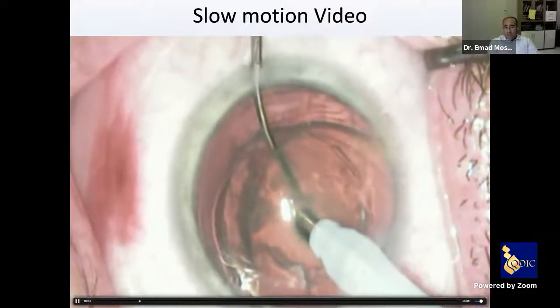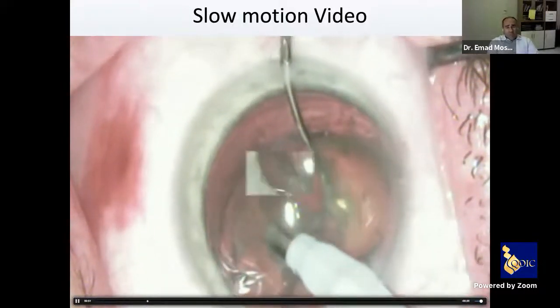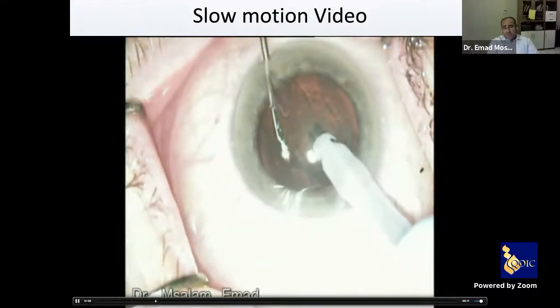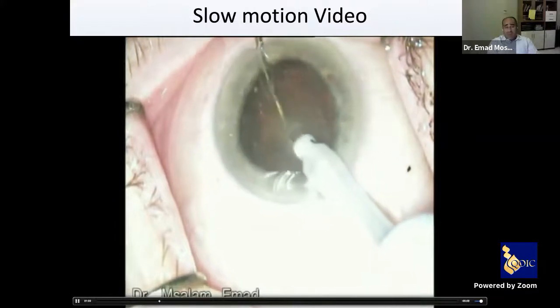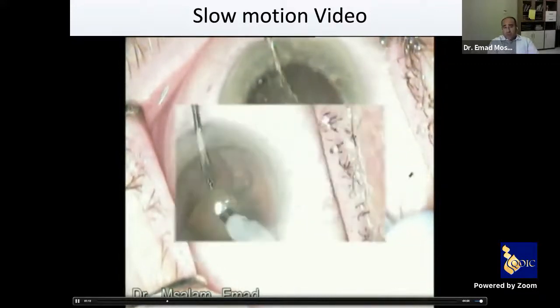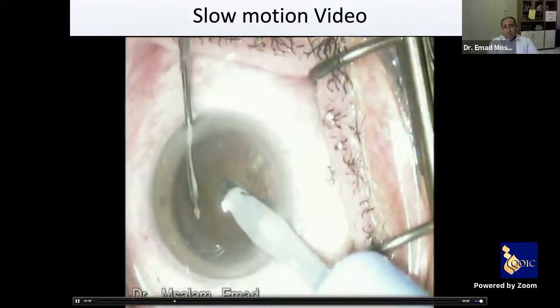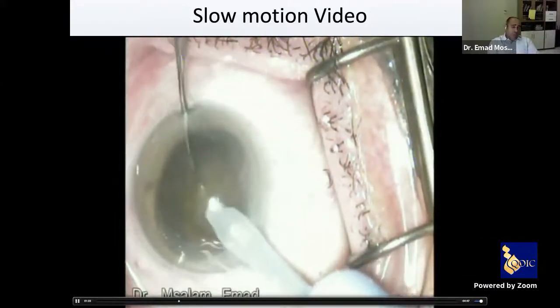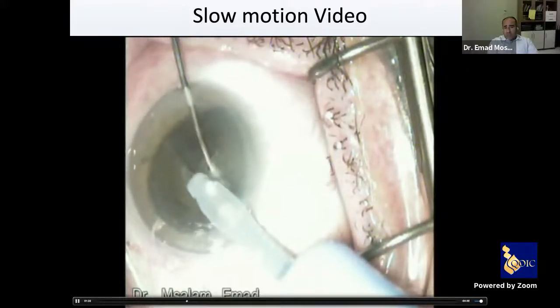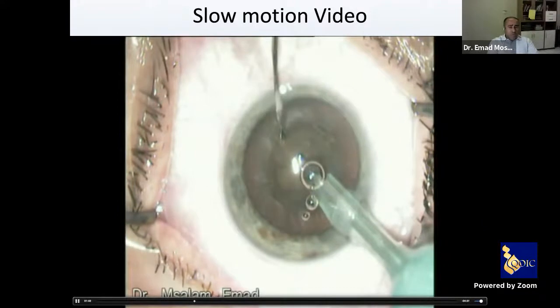And as you see how we are performing and how we are keeping the epinucleus, moving the epinucleus material with this spatula just to create more protection for the posterior capsule. We call it manual dissection, which means we are just moving the epinucleus with this spatula. As you see, we insert the phaco tip, move the nucleus a little bit, and at the same moment move our spatula under the nucleus and perform the first chop. It's easy. It's a very safe spatula. It doesn't have any sharp edges to damage the capsule or iris.